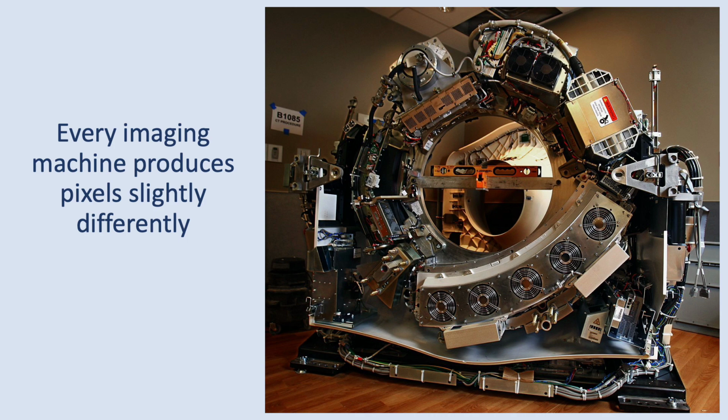And every imaging machine produces these pixels slightly differently. The machines are just built differently, and the techniques, both the mechanical things and then the programs that they use to acquire them and filter them, are different.